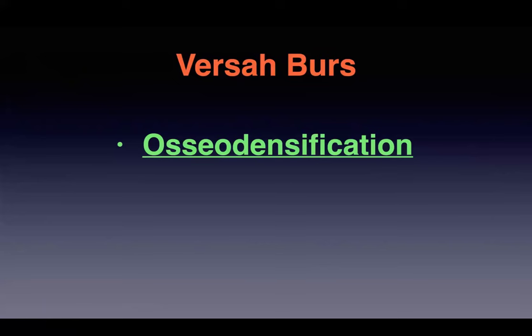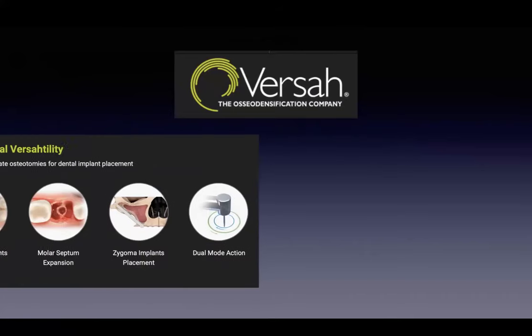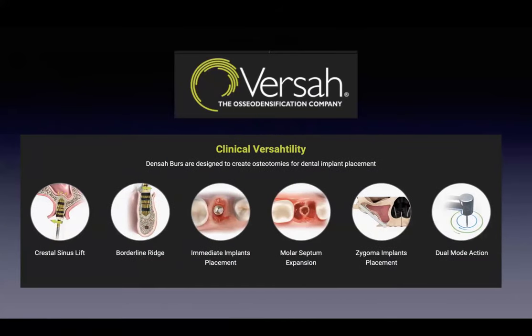Next, we're going to be discussing Versah burrs. These burrs are compatible with most implant systems out there. And you can go to the website, download the burr reference chart that corresponds to your implant system. It's an osseodensification procedure where it doesn't remove bone, but rather condenses it. And also just a lot of different uses for it.